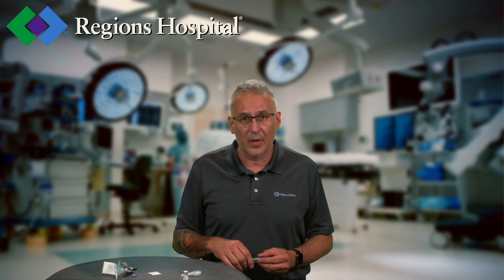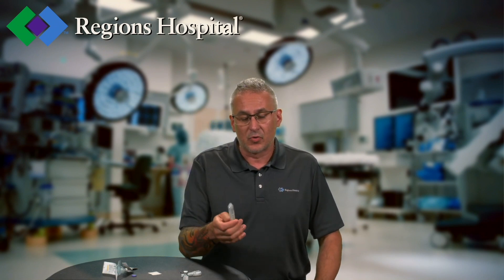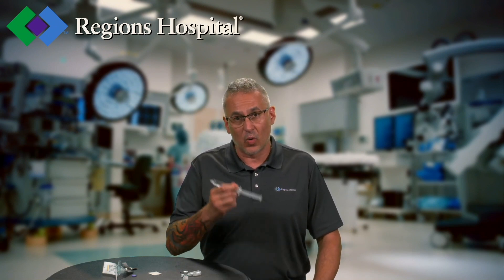If you find yourself needing to give epi 1 to 100,000 — the epi bumps that we have in our guidelines — you can go ahead and get rid of 9 cc's of this mix, drop in 9 cc's of normal saline, and convert this 1 to 10,000 mix into a 1 to 100,000 mix.